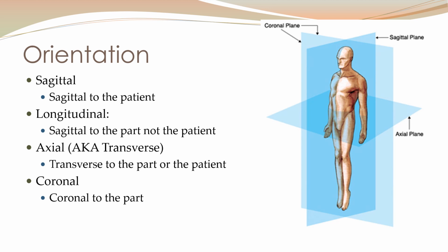Okay, and then coronal. We also can scan in the coronal plane, which would mean, if this is the coronal plane, I would have the long axis of my transducer scanning into the patient with the beam going in such a direction within the patient's coronal plane.